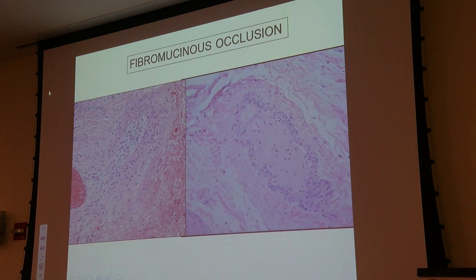thrombus. And again, the late stage lesion will literally be a plugged artery, plugged with collagen and mucin, with a variable lymphocytic infiltrate that ranges from being lymphocyte rich to this scarred blood vessel.